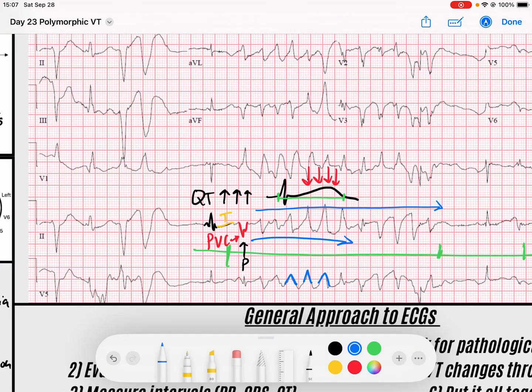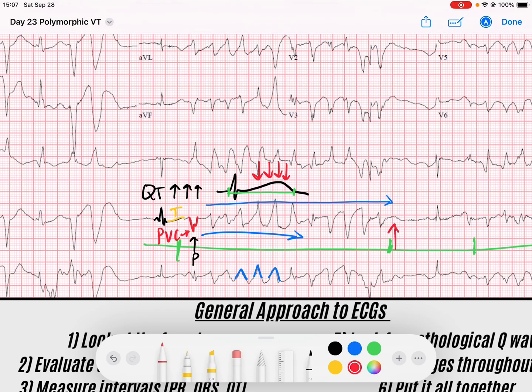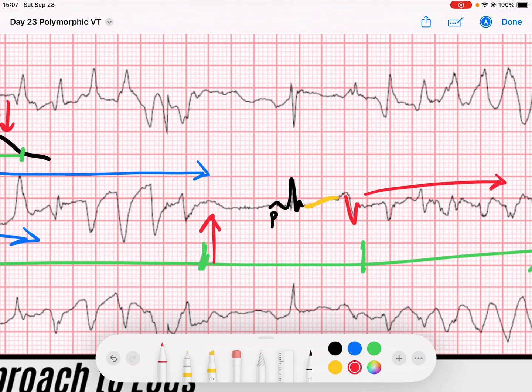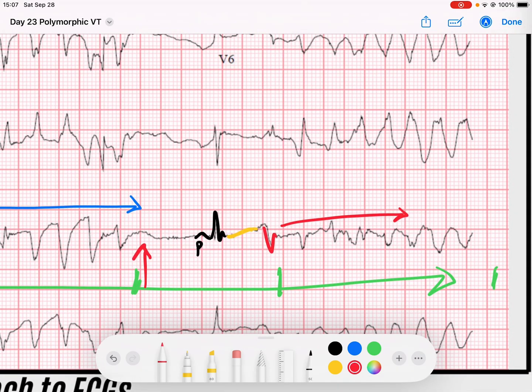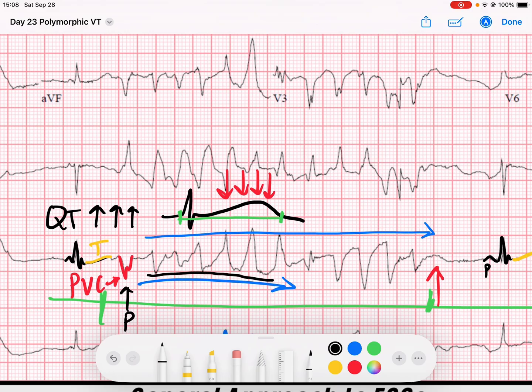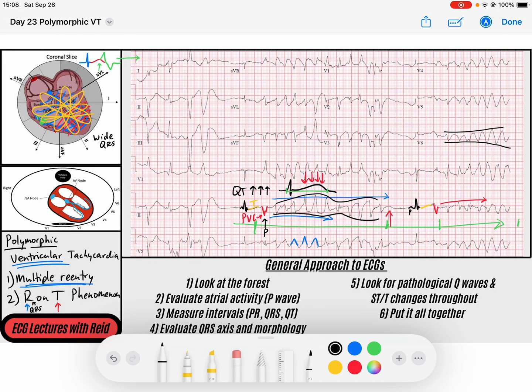Then notice what happens — we get a polymorphic wide complex rhythm. Fortunately in this case, this is non-sustained; see how it terminates here and we get another narrow complex beat. Look — another P wave followed by a QRS complex, then a T wave, and before the T wave can get back to baseline, we get another PVC that initiates that torsades rhythm. Notice it's almost predictably going from narrow to wide, narrow to wide — a ribbon-like appearance. In torsades, the reentry pathway is due to the fact that some but not all of the myocardium has recovered.